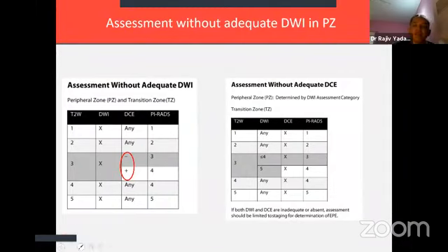Ideally, the radiologist will be there to monitor. So what they should be doing is a non-contrast image in all the patients, and only if they feel that contrast will be needed, they can always decide to do contrast at that point of time. So does dynamic contrast enhanced image contribute in most of the large peripheral tumors?